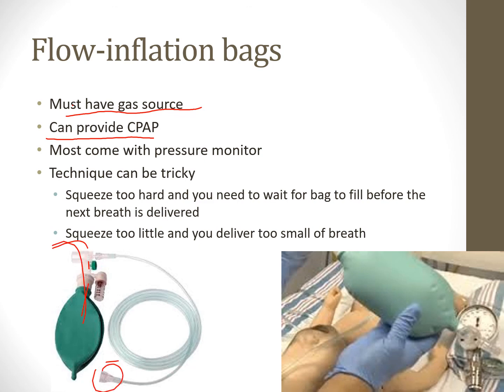It also does specific FiO2s. We just hook it up to a blender and we tell it 30% FiO2 or 0.30, and it gives 0.30, right? We could also feel their lung compliance, how hard it is to bag or how easy it is to bag. We could also feel that compliance factor as well.